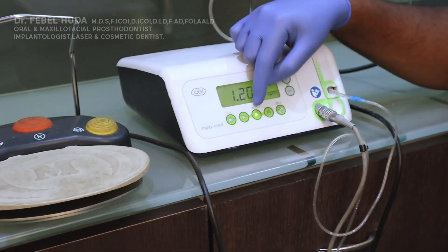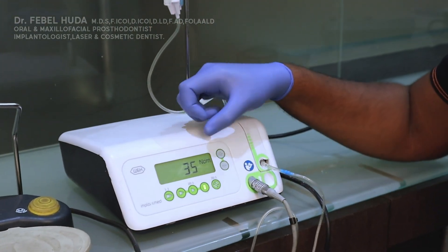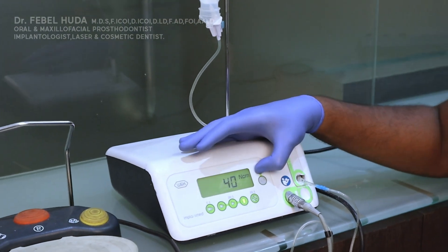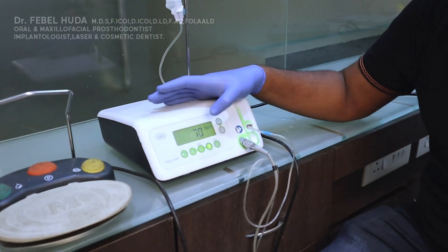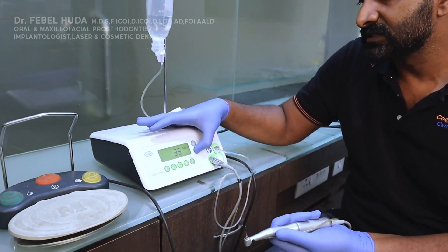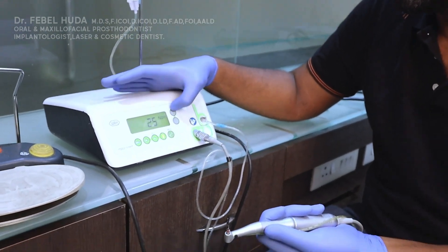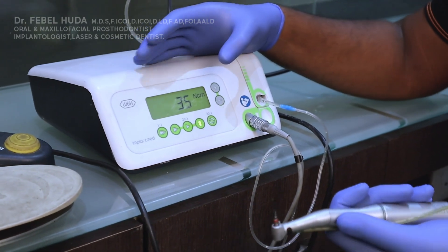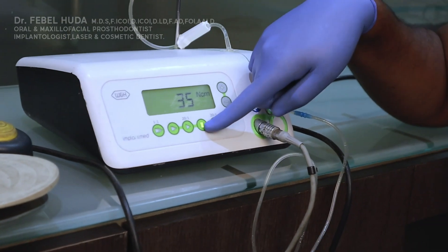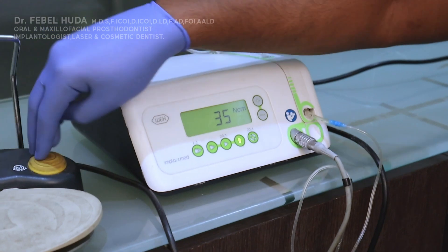In the implant drive mode, you can change the torque in Newton centimeters. The maximum torque is 70 Ncm and the minimum is 5 Ncm. You will typically keep it at the optimum of 35 Ncm, which is the minimum required for primary stability.